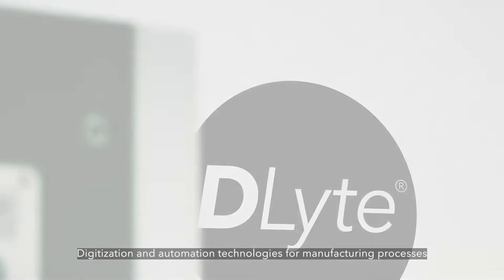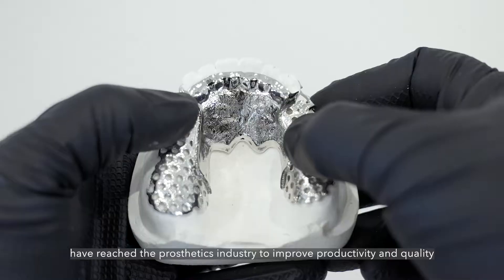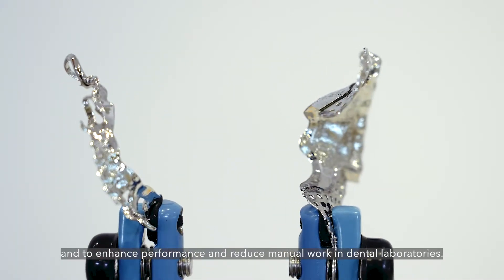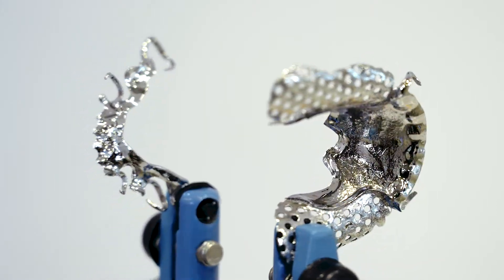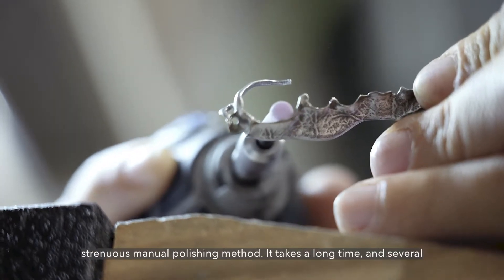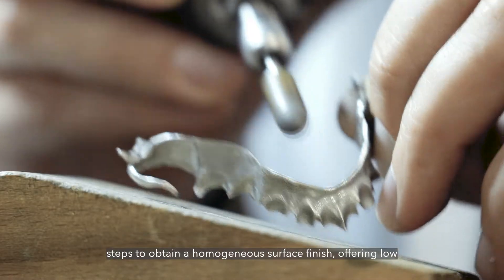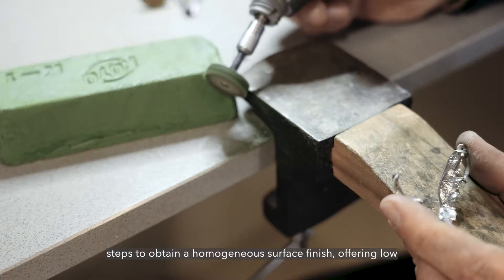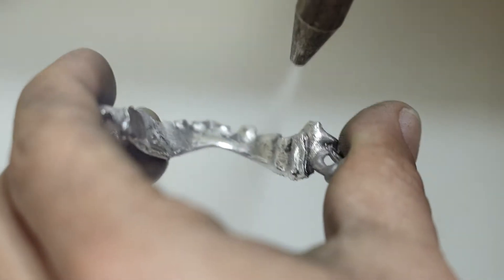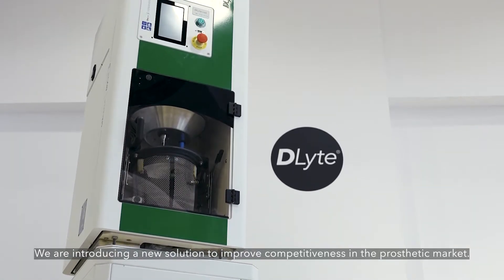Digitization and automation technologies for manufacturing processes have reached the prosthetics industry to improve productivity and quality and to enhance performance and reduce manual work in dental laboratories. However, polishing of metal dental pieces has remained a tedious and strenuous manual polishing method. It takes a long time and several steps to obtain a homogenous surface finish, offering low productivity and generating dust, dirt and noise in the laboratory. We're introducing a new solution to improve competitiveness in the prosthetic market.